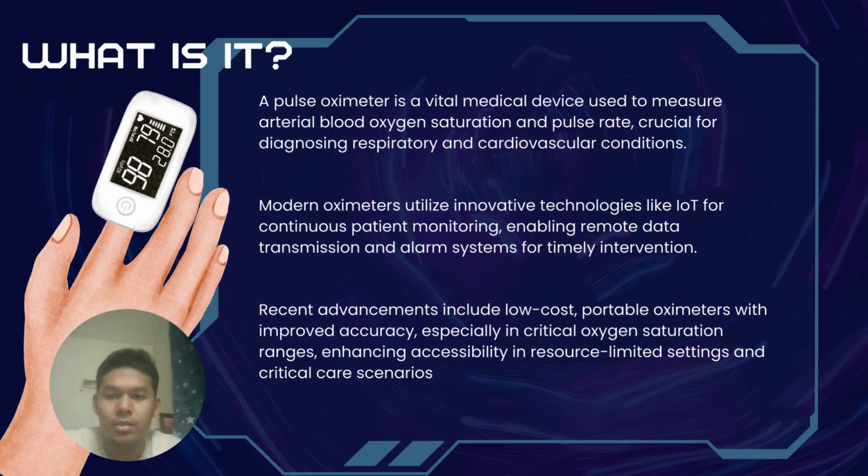So basically, what is a pulse oximeter? A pulse oximeter is a vital medical device used to measure arterial blood oxygen saturation and pulse rate, crucial for diagnosing respiratory and cardiovascular conditions. Modern oximeters utilize innovative technologies like IoT for continuous patient monitoring, enabling remote data transmission and alarm systems for timely intervention.